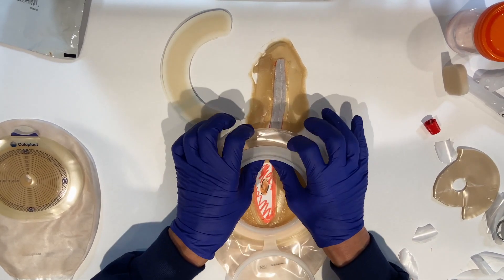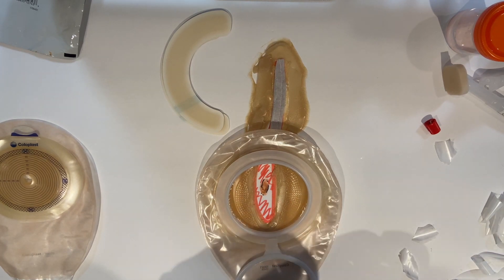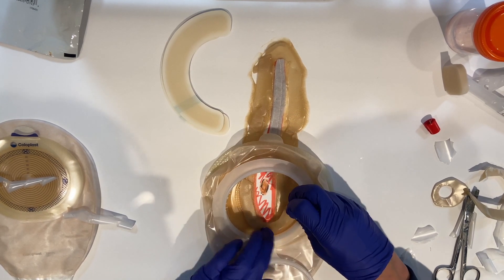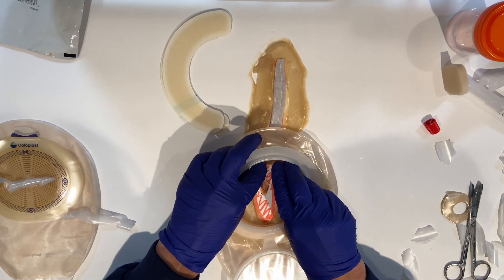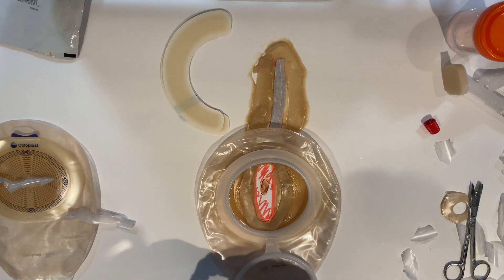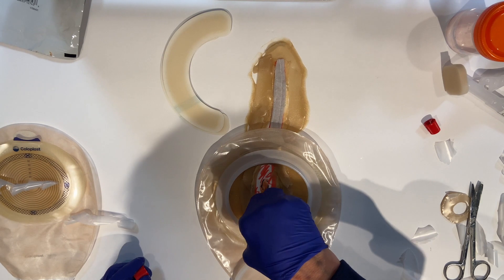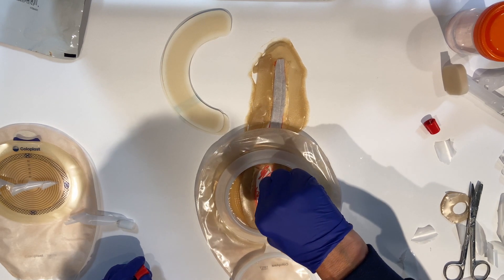Then you're going to cut some more of your barrier ring and sandwich that pouch between the two barrier rings. This is going to give you that leak-proof pouch that you're still looking for. Finish it off all the way around top and bottom. Then it's time for a little bit more paste. It seems like a lot of steps but it really doesn't take that long once you get it down. You can be more generous with the paste especially down at the base on the second go around — the first one you want to keep it lean, the second one you can be mean.